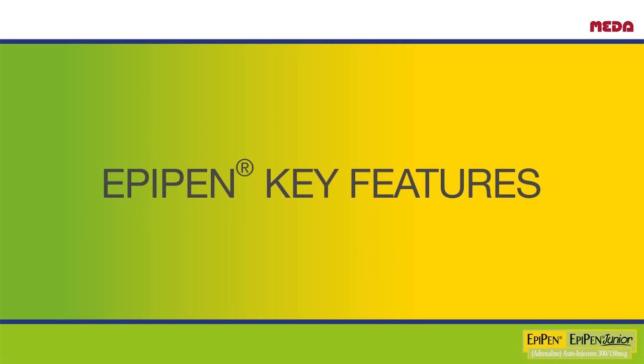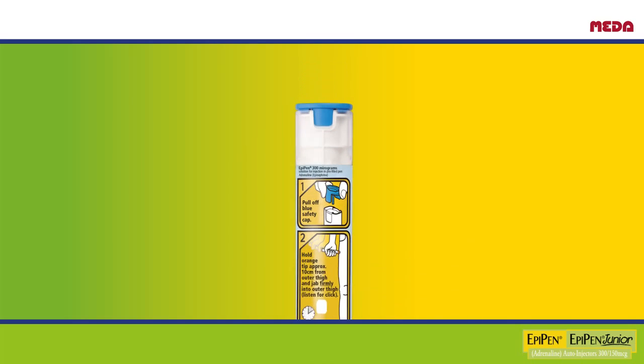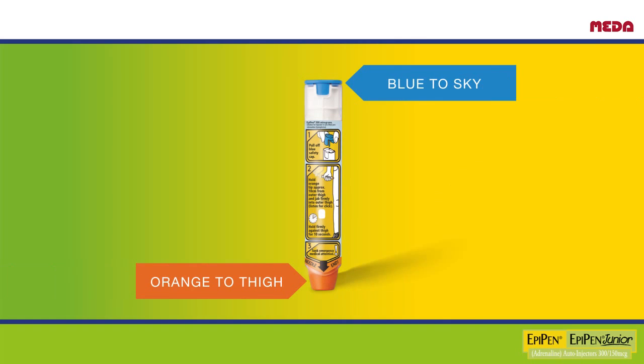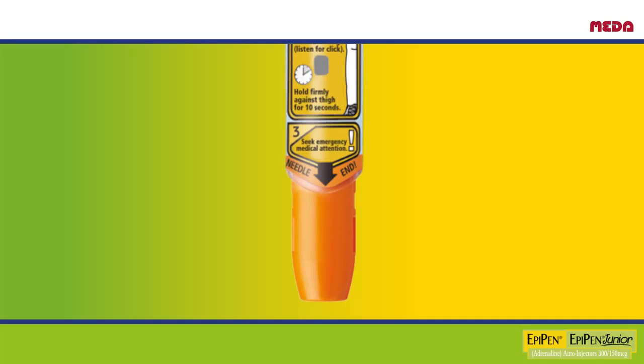The EpiPen is clearly colour coded. The safety cap is blue and the needle cover is orange, so you can quickly see which end is which in an emergency. An easy way to remember this is: blue to the sky and orange to the thigh. The needle sits inside the orange casing, and this casing automatically covers the needle once the EpiPen has been used, so that you never see the needle. It also protects you from unintentional needle injuries following use.